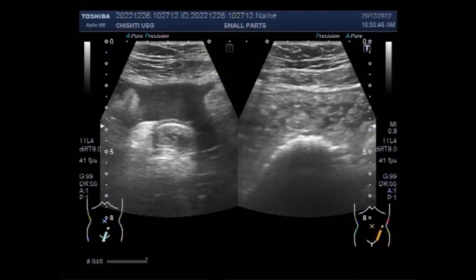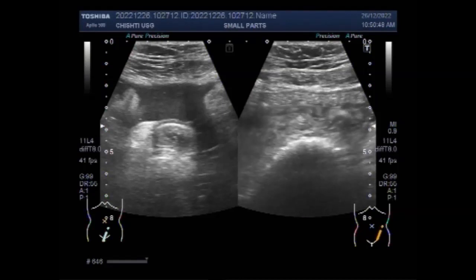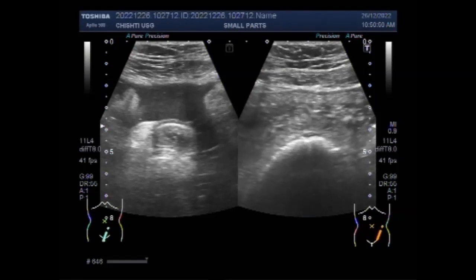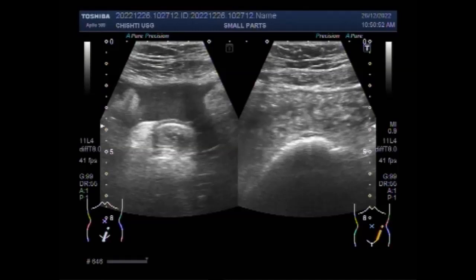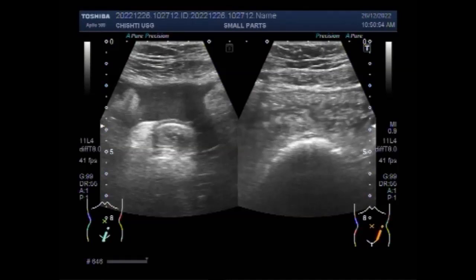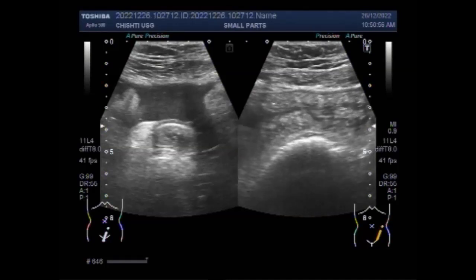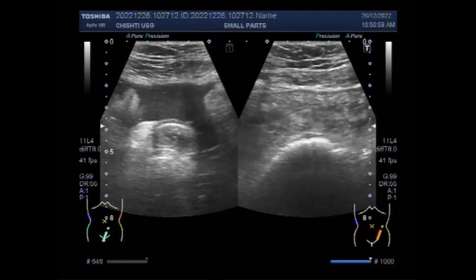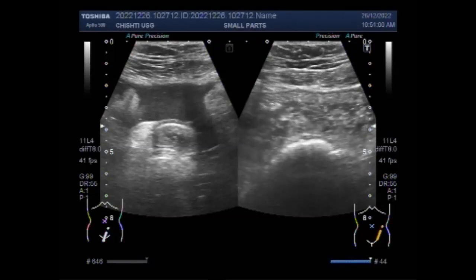On supine images, small bowel obstruction often demonstrates a step-ladder pattern of dilated, distended loops of the bowel that appear stacked on one another. A variable amount of gas is seen in the colon depending on the severity and duration of the obstruction. A gasless abdomen can also be seen if distended loops are fluid filled.